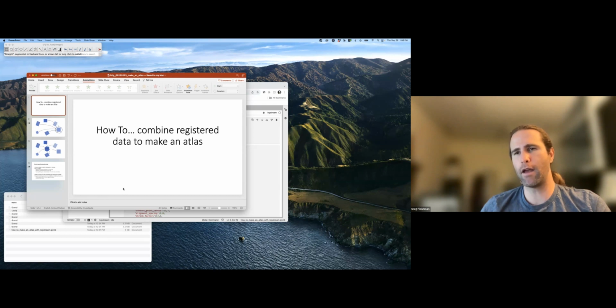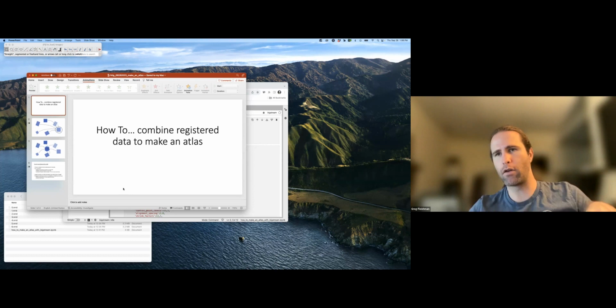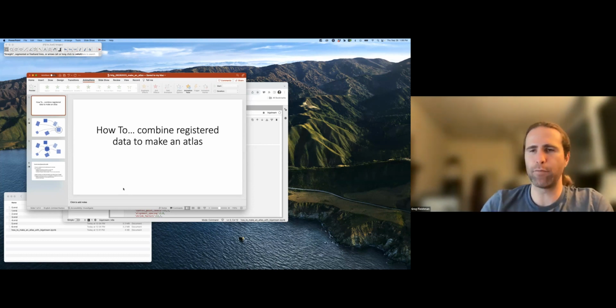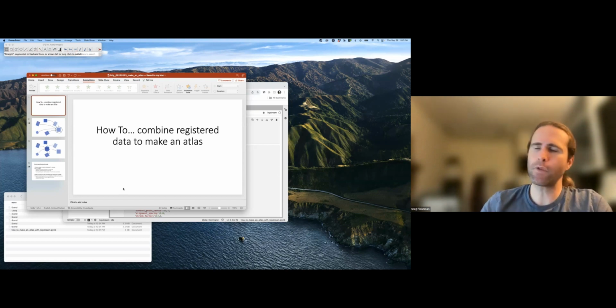That is, to create an average image, or an atlas, if you want to call it that, of all of your subjects' data, and then register only that study-specific template to the public data set. So that way you have the public data set here, the study-specific template here, and then all your subjects are registered to your study-specific template by default because you had to register them in order to make the study-specific template.